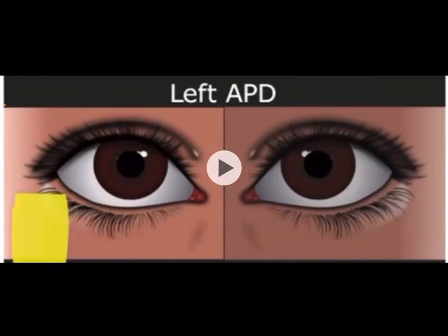The first step is permission from the patient. Okay. Okay, Mr. X, I would like to examine the back of your eye with this machine, not with this ophthalmoscope, with this machine. Okay. And I will need to dim the light to be able to see clearly. So permission for examination and permission to dim the room light.